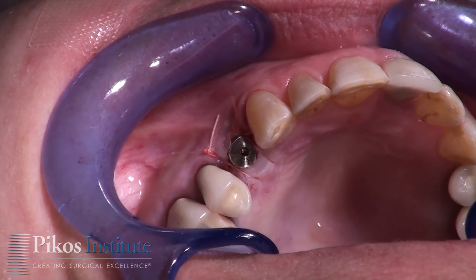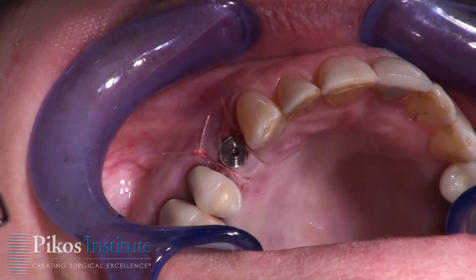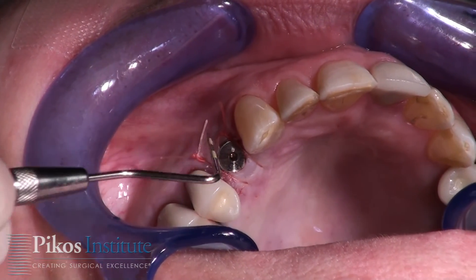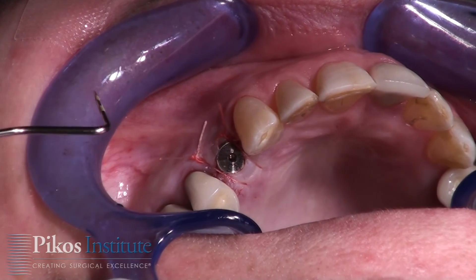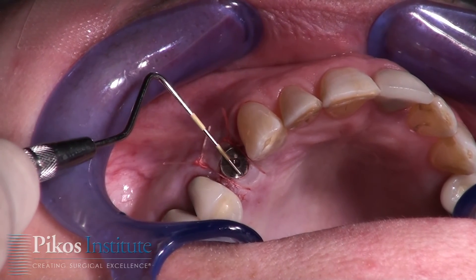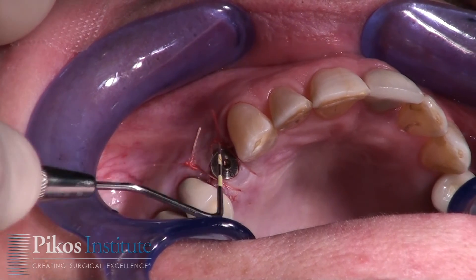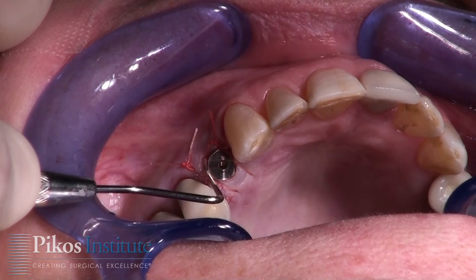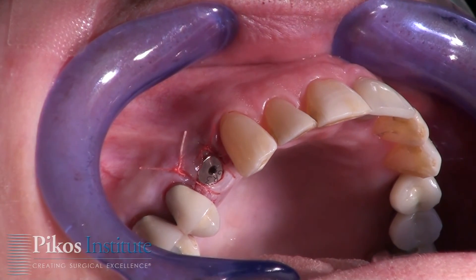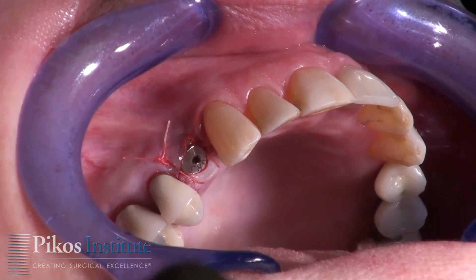We've placed this 4.6 millimeter by 12 millimeter length Bio-Horizon tapered internal laser-lock implant into the number five site, maxillary right first bicuspid. We made an H-configuration incision, mid-crestal sulcular envelope flap, did a little crestalplasty, placed the implant non-submerged with good insertion torques and a 3mm right healing abutment. Primary closure was achieved using the existing flap keratinized gingiva, resecting tissue from both the palatal and buccal aspects. Approximately 10 to 12 weeks of healing will follow, then we'll verify integration and complete the implant-abutment-crown complex.